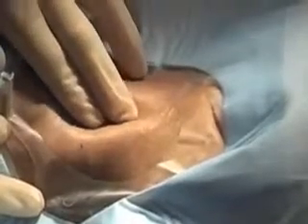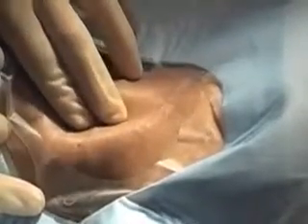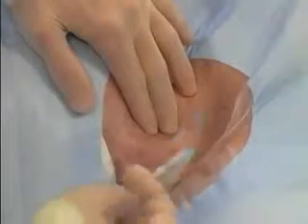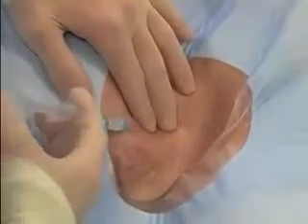During needle puncture, palpation of the carotid artery can be maintained with the non-dominant hand. In a patient who is awake or minimally sedated, the skin should be infiltrated with a local anesthetic, such as 1% lidocaine, with a 25-gauge needle to help minimize pain on insertion of the catheter.